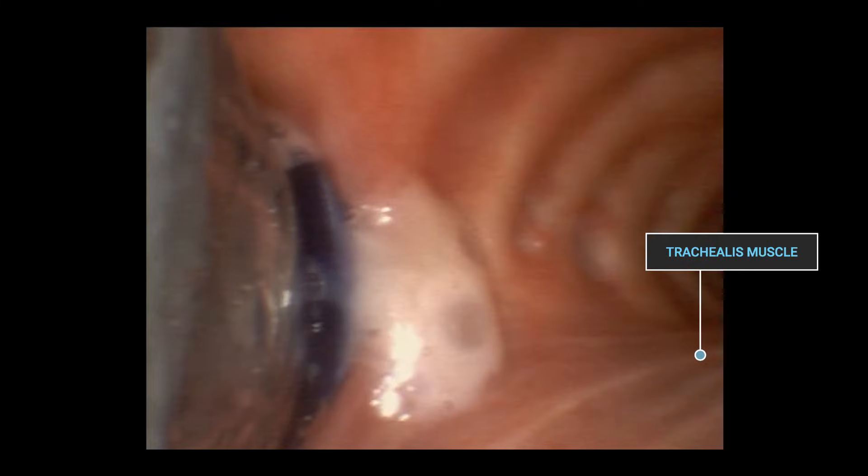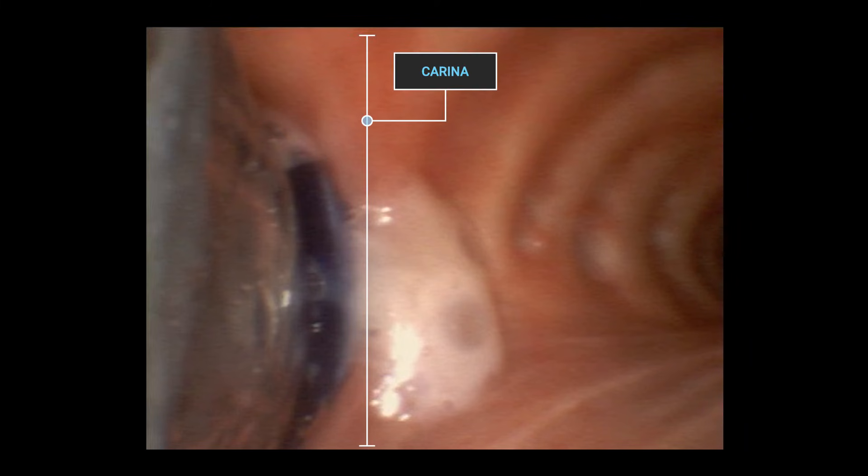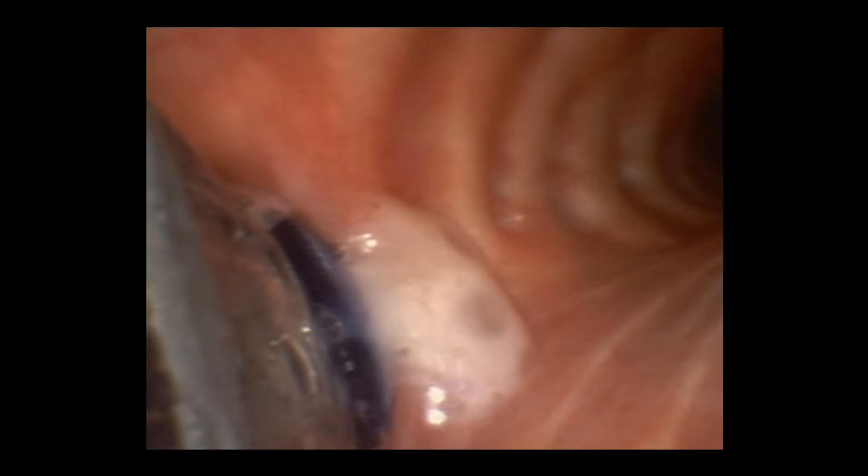We'll now demonstrate how to confirm correct tube placement bronchoscopically. First, ensure correct orientation by identifying the trachealis. If the tube is placed correctly, we should see a small rim of blue bronchial cuff in the left main bronchus. To check we're definitely looking at the true carina, advance into the right main bronchus and identify the unique right upper lobe with three divisions.